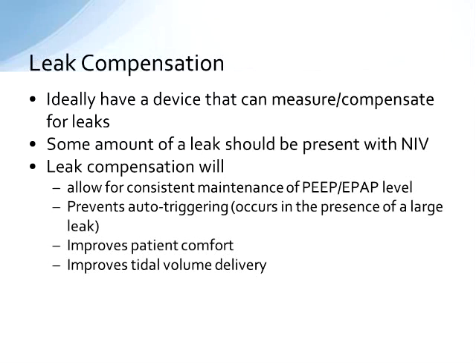Leak compensation is really important because it measures and then compensates for the leak that's coming out around the mask or maybe through the whisper valve or exhalation valve. This allows for consistent maintenance of your EPAP, and helps to prevent auto-triggering, which is the case when you have a big bad leak. If you don't know that it's there, it can cause auto-triggering and make your patient very uncomfortable. It can also improve tidal volume delivery, because you don't want your tidal volume being pumped out to the room. You want it to be delivered to your patient. So leak compensation is very, very important.